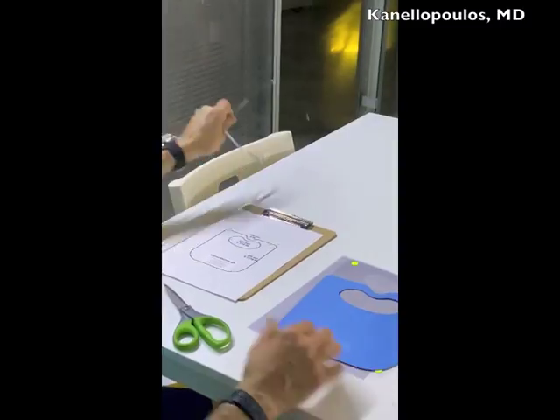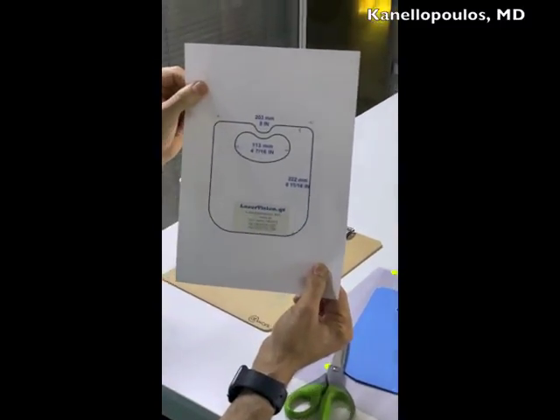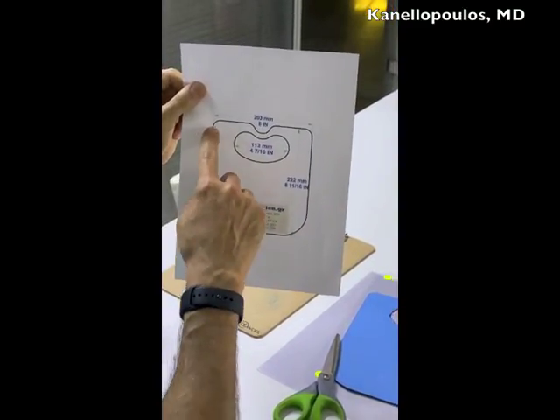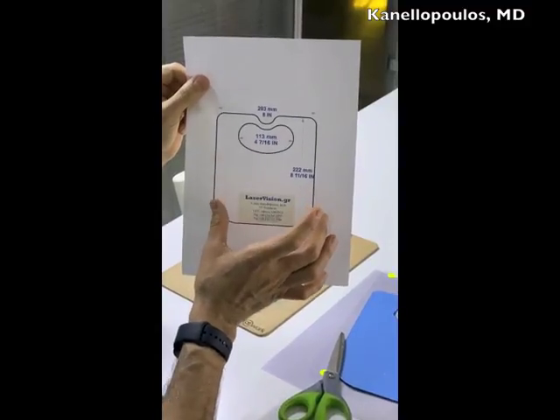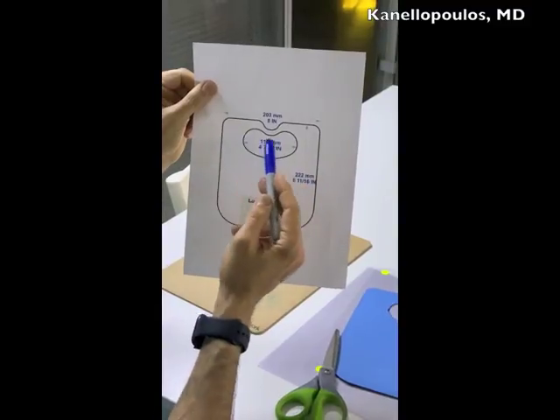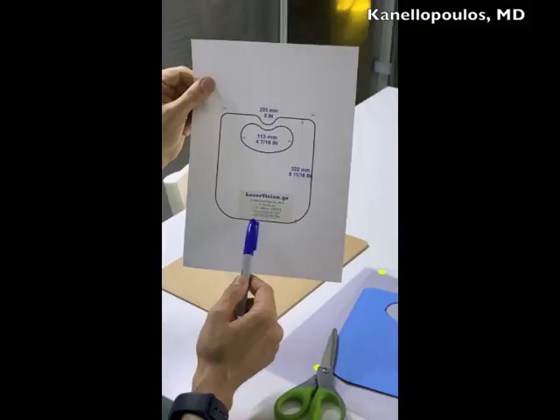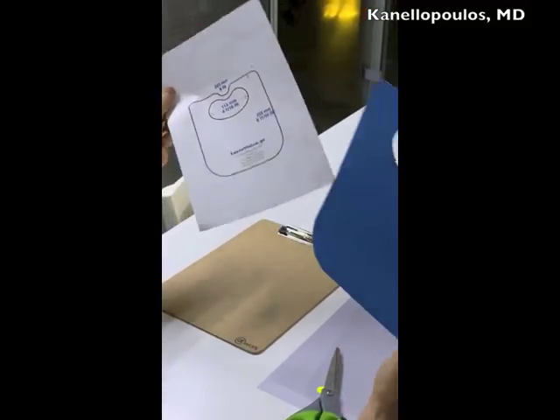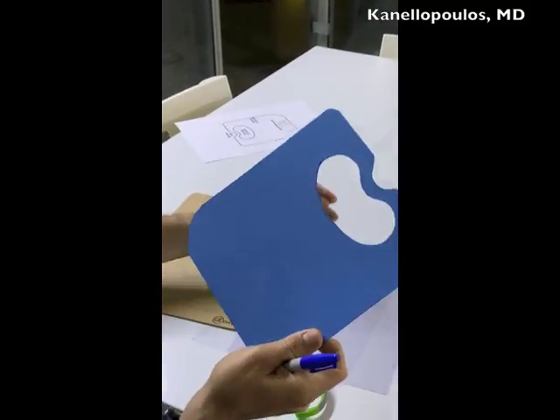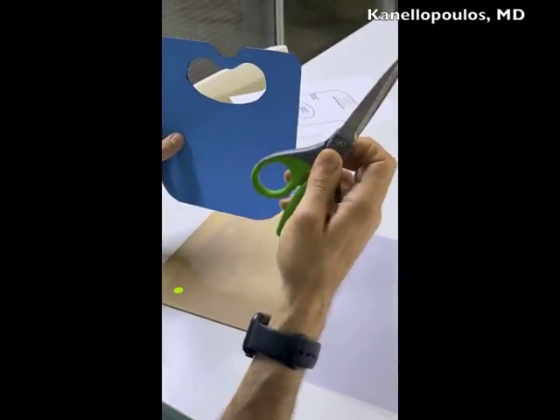These are the actual dimensions, and I'll include these in the video as a readout. This is taken from a commercially available acrylic or plexiglass product available out there, and obviously this opening here will fit your slit lamp or microscope oculars, and this is in millimeters and in inches. And from this we've made the actual template with a cardboard. It's very easy to do, with very sophisticated instruments of a ruler and a pair of scissors.